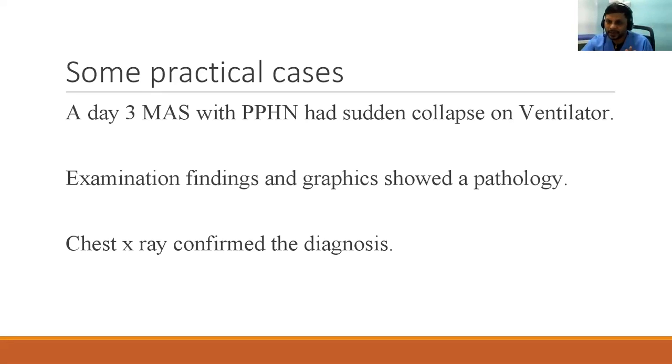If the ventilator is working well on the test lung, that means equipment failure is ruled out. And if while you are bagging the baby you notice a good chest rise, that rules out both tube displacement and obstruction. That leaves pneumothorax as a good possibility.